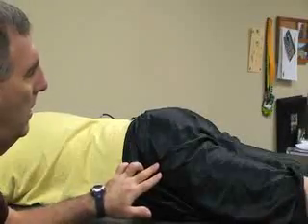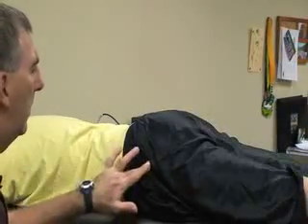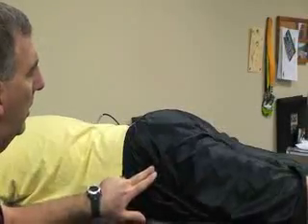The next goniometry measurement is going to be hip extension. For this, I'm going to have him in a prone position with his knee extended down the table, and towards the edge of the table so I can get a better reading. My fulcrum is going to be at the greater trochanter again. I can have him internally and externally rotate the hip just to make sure that's where it is.